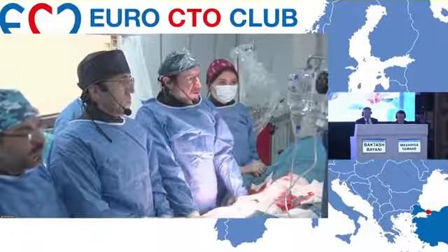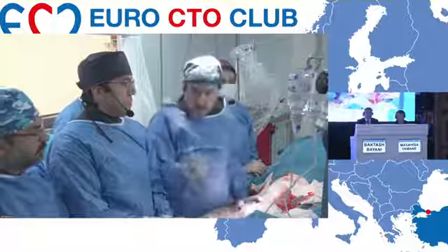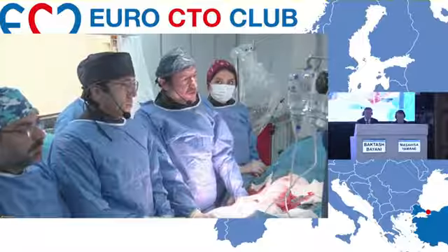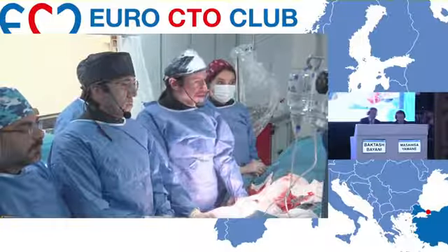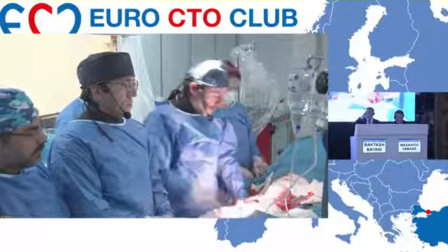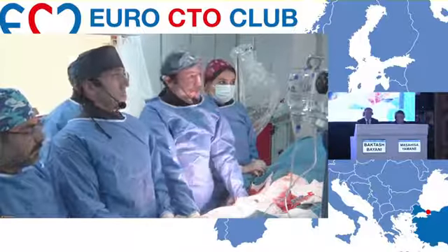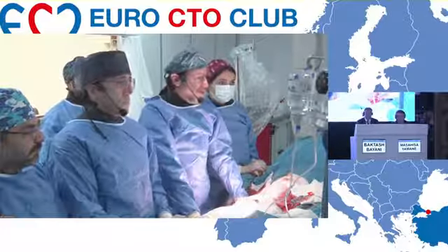Let us first present the case, but I want to also introduce my team first. We have Ömer and Şeref. I'm doing the case with Şeref, and we have Merve here. Merve is holding the arm of the patient because there is a bleeding from the radial artery. Our setup is biradial, but the patient is still under oral anticoagulant, so he didn't stop that. We have to be very cautious here, and therefore we are using a biradial approach. So let us first introduce the case and then see what we're going to do.